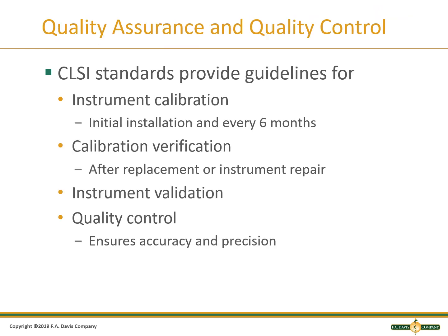So I was working through those slides. I tried to stop for a few seconds on each slide, getting to the point that we were past all the specific instrumentation. That way, if you're watching it and you wanted to pause it at that point to read it, you could. So now we're going to talk about quality assurance and quality control.